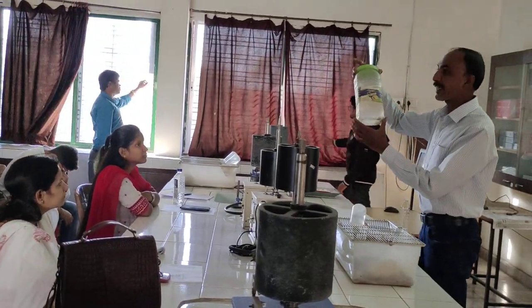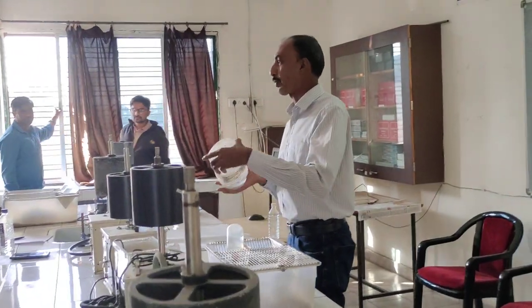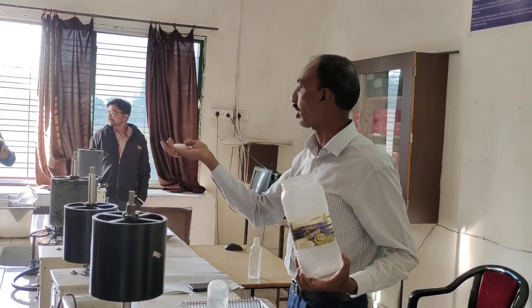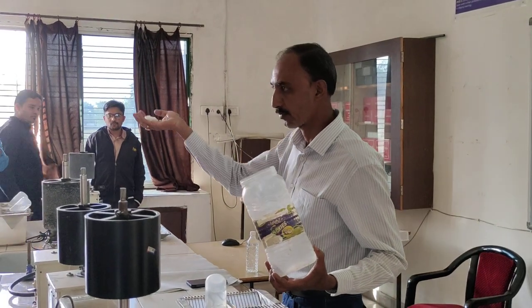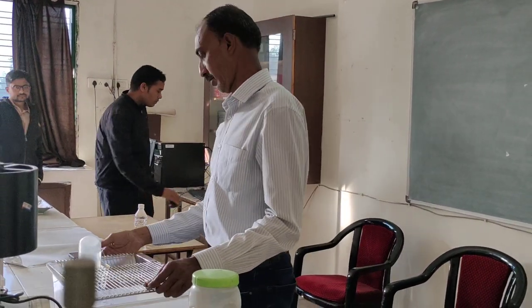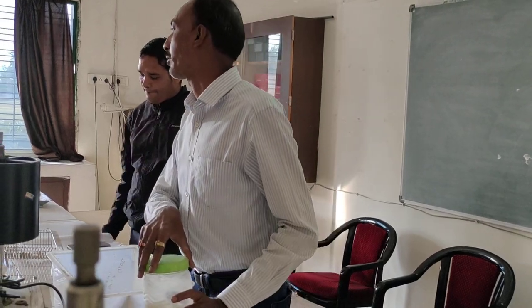See, this is a transparent case. In this transparent case, we have prepared some cotton balls. These cotton balls are soaked with halothane anesthesia. Now what we have to do? We have to close it. How to anesthetize the animal?